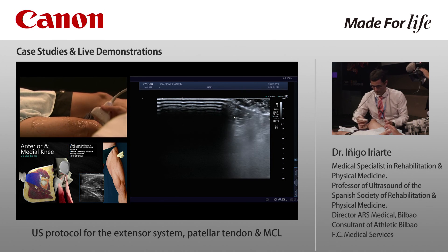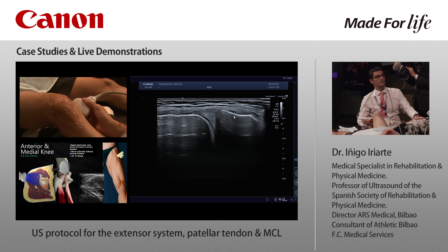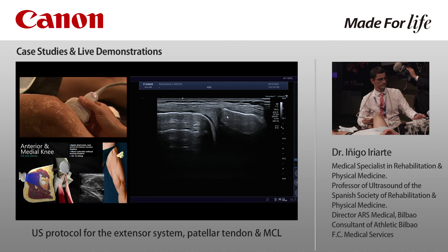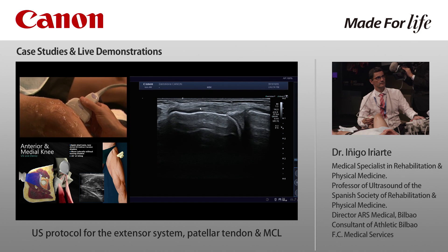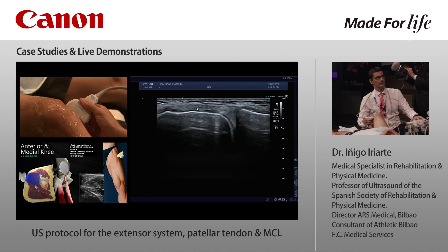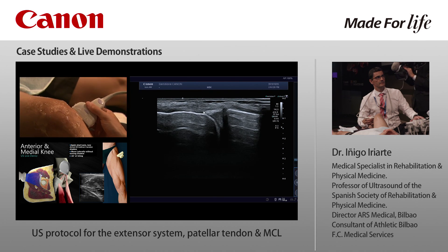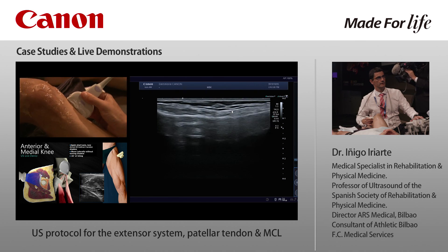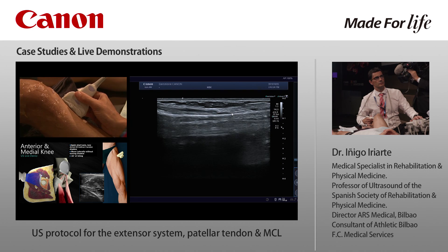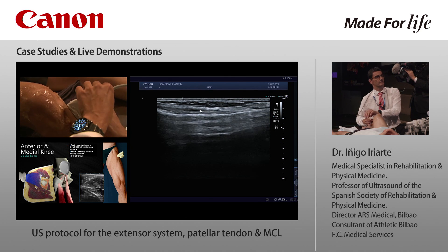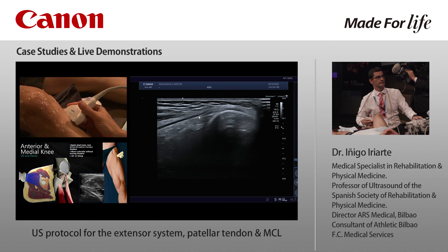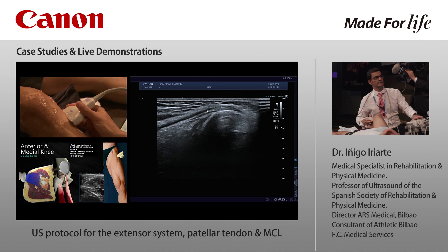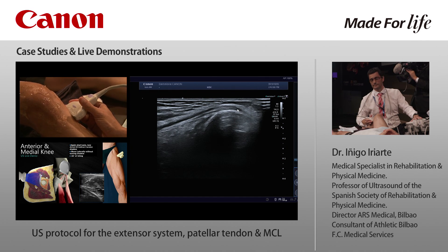To finish, the medial collateral ligament. We place the probe on the medial side. You can see the medial meniscus, the superficial layer of the medial collateral ligament, and the deep layer — with the meniscofemoral ligament and the meniscotibial component. Following the ligament distally, the superficial component ends here, and this is the pes anserinus. Turning the probe, you can see the pes anserinus inserting into the tibia.